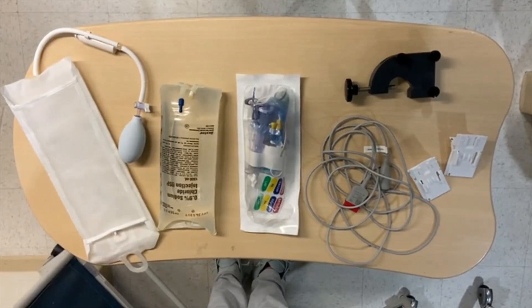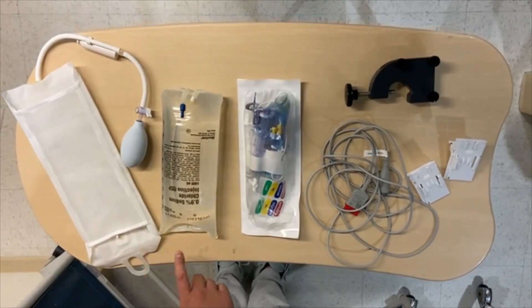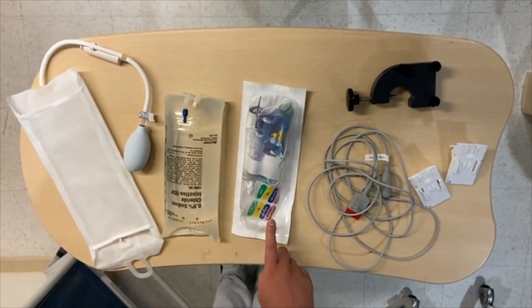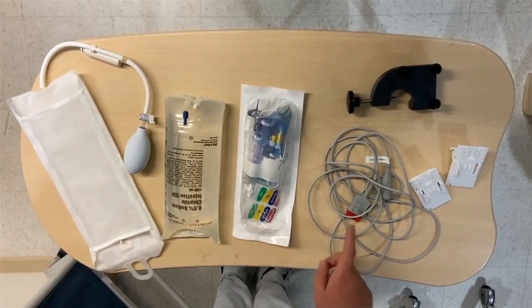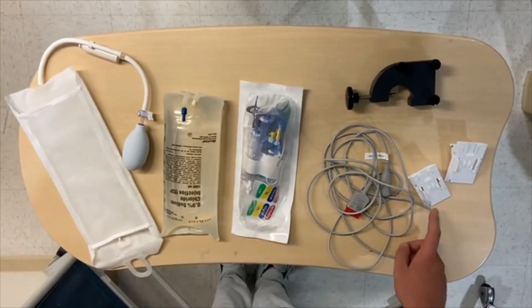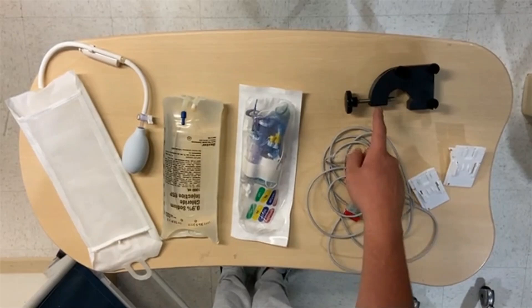Here you'll see all the supplies that you need: one pressure bag, one bag of normal saline, one transducer set with safe set reservoir, one transducer pressure cable, one transducer holder, and a C-clamp.